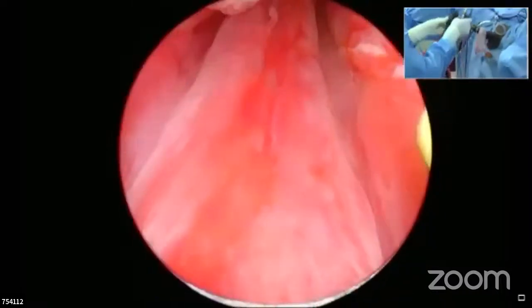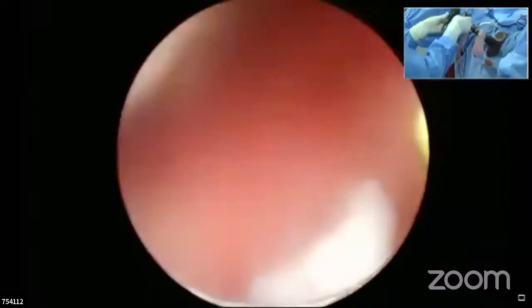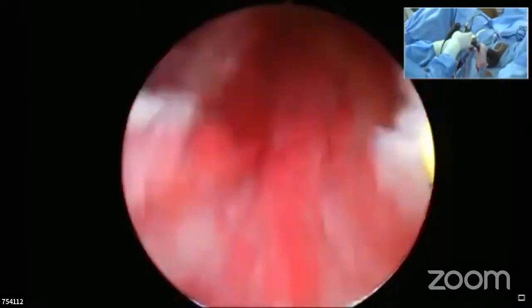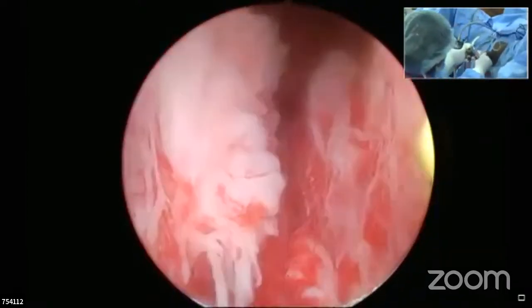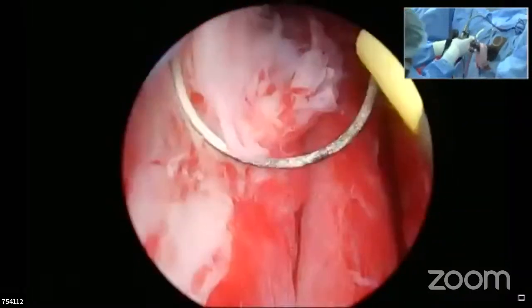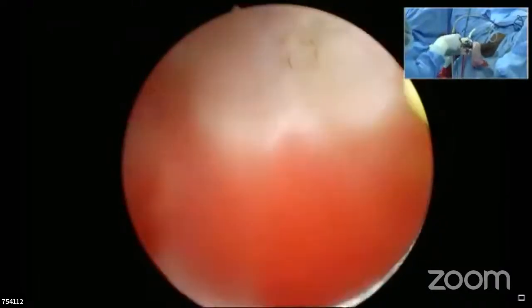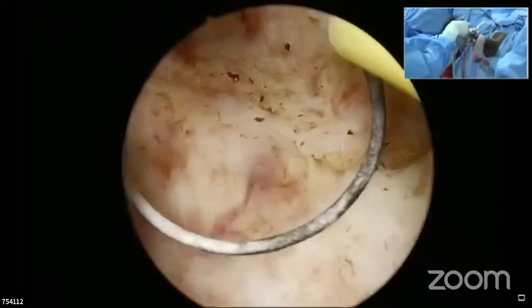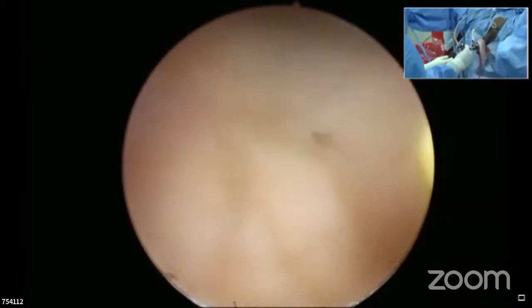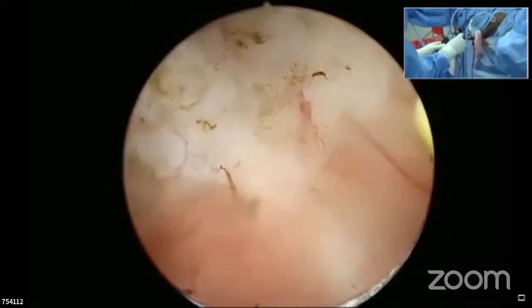Coming back, this is the amount of lysosphincter segment which is saved. And this is the region of the sphincter. And almost 1.5 centimeters of lysosphincter section is saved even beyond the Veru, with complete excision of the apical region. So we'll just complete the hemostasis further, and the small nodule elevations which are there, we'll shave them off, and that should be the end of the procedure, sir.